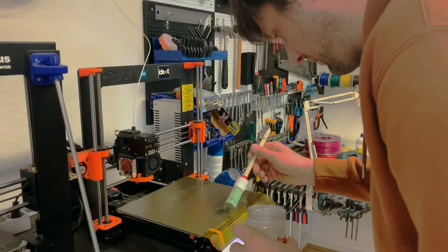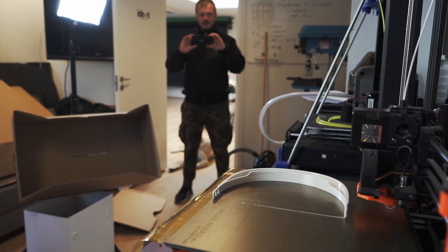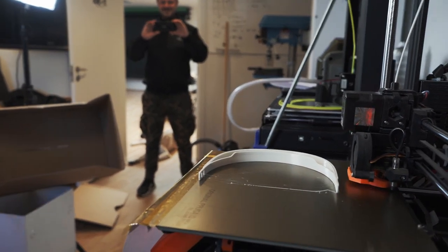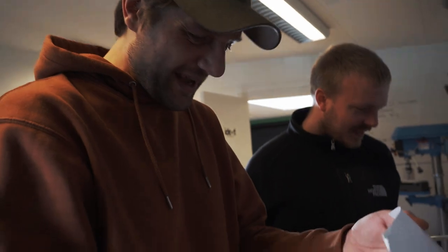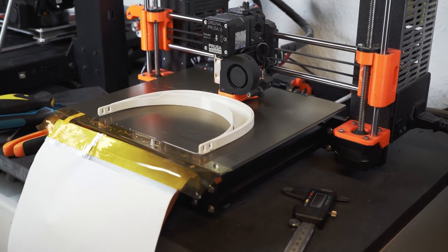I had trouble with bed adhesion — it was too much because I used ABS juice. So more experimenting with the actual concentration and how and where I apply the ABS juice. Should I print more and move the part? Should I print one part, shove it off and print on the same spot again? After all these experiments, it worked. I got it. I have automatic production of corona shields up and running.